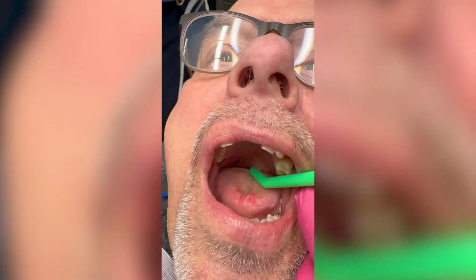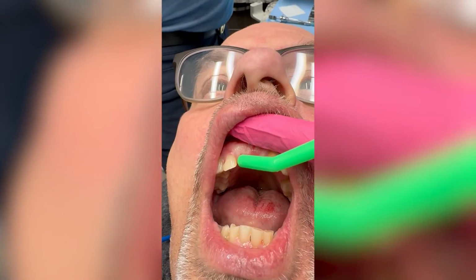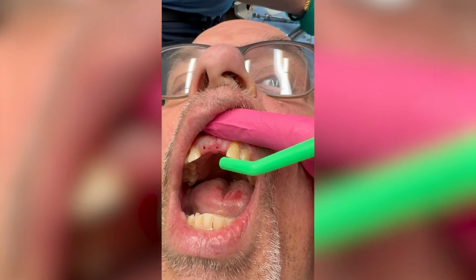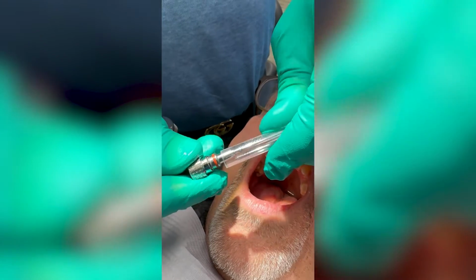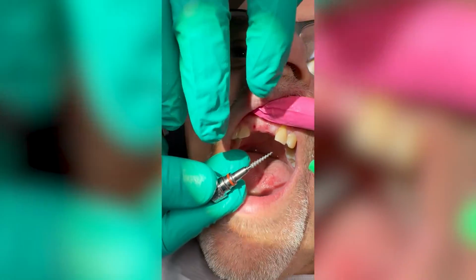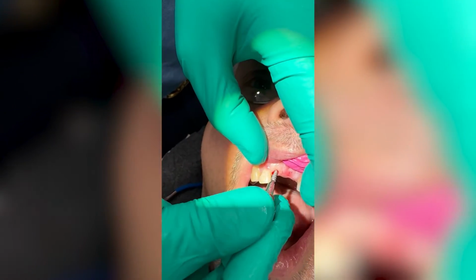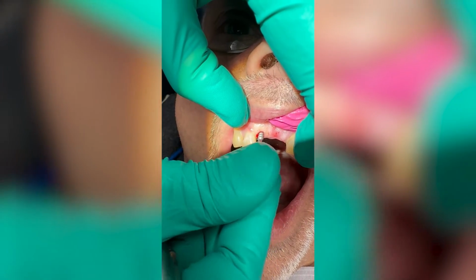Okay, there's our first pilot hole. Okay, so we made our pilot hole, and now we're going to take the implant out of the sleeve with this carrier. And we're going to go right to the patient's mouth. And one thing I want to show you is the aggressive thread design on the mono implants. The Shatkin F.I.R.S.T mono implant is a very aggressive thread, and it engages the bone very, very nicely, as you'll see. So we screw the implant in until we get good resistance, and I'm getting very nice resistance.